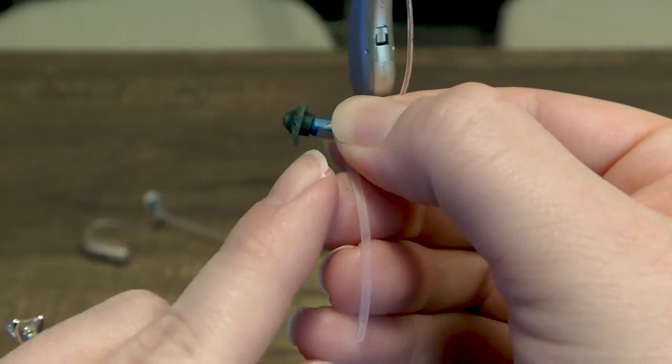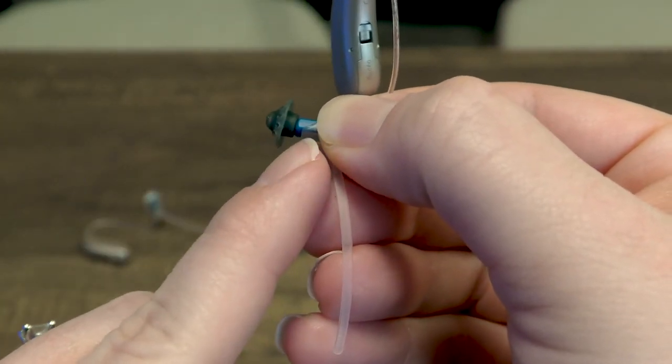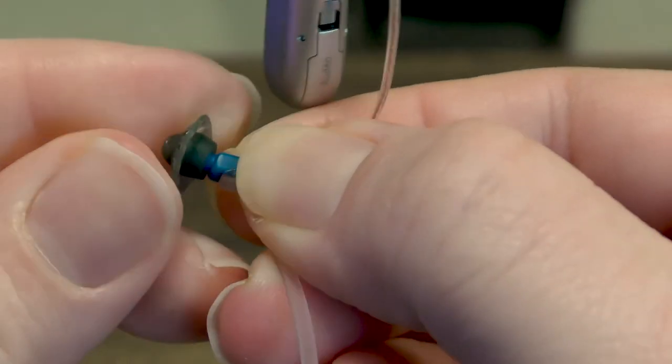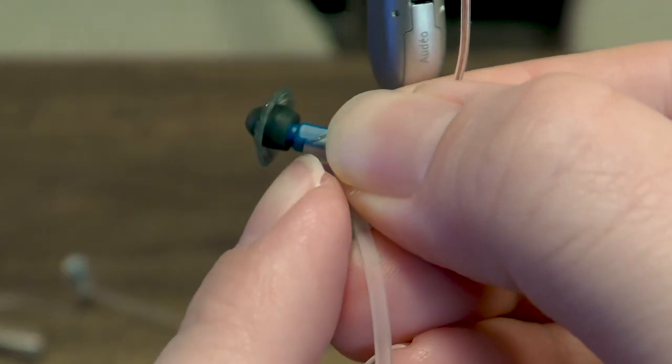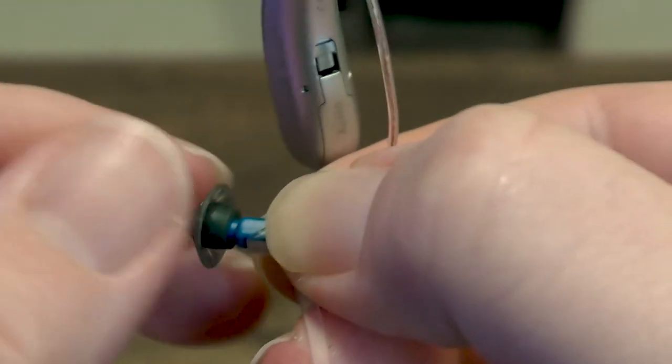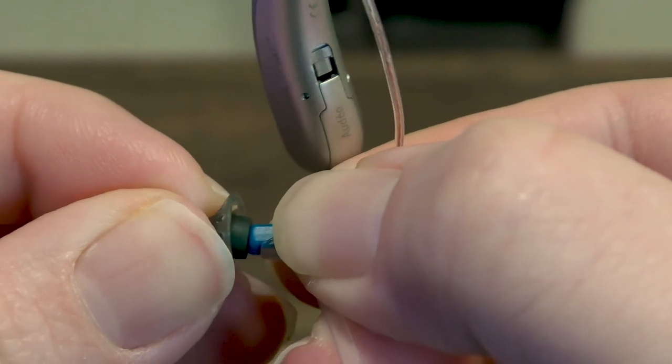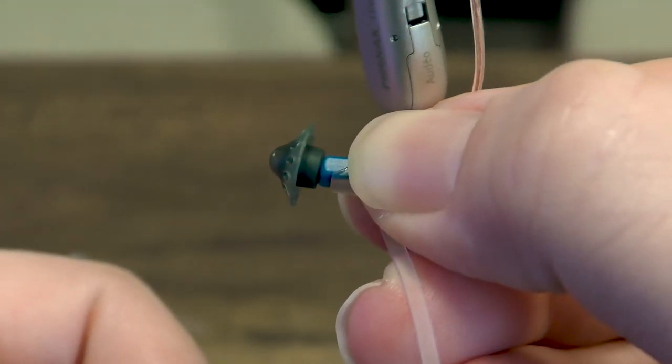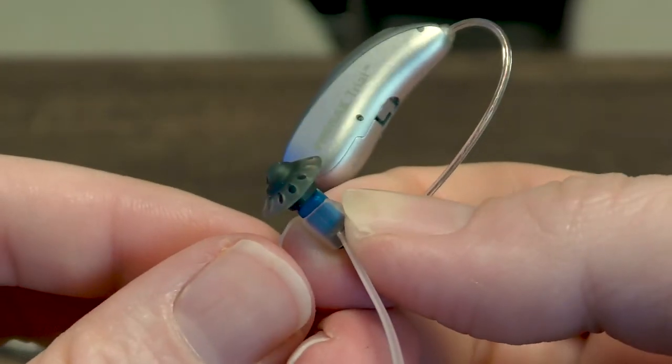I always like to make sure that the dome is all the way on the hearing aid or on the speaker. So for example like that it's not quite fully on to the speaker. You see the little gap right there? So you just want to press it on, make sure that it's fully onto the speaker and that's how you change the dome on the Phonak Marvel.